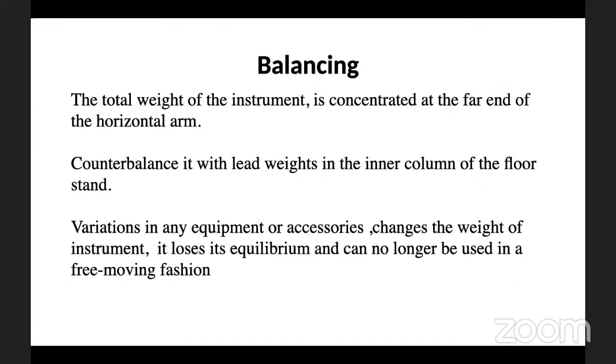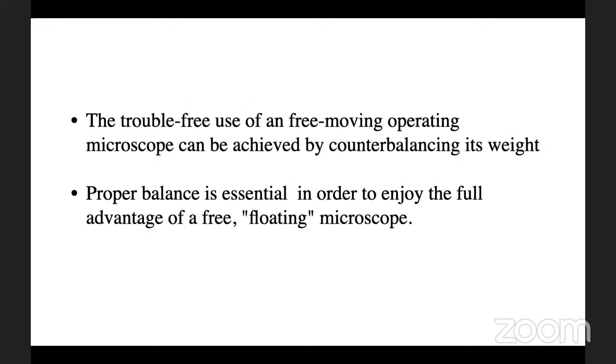For balancing, the total weight of the instrument is concentrated at the far end of the horizontal arm with the optics. So it should be counterbalanced with weights in the inner column of the floor stand. Variations in any equipment, or changing the accessories, change the weight of the instrument. So it loses its equilibrium and can no longer be used in a free moving fashion. Trouble-free use of a free moving operative microscope can be achieved by counterbalancing its weight. Proper balancing is always essential in order to enjoy the full advantage of a free floating microscope.